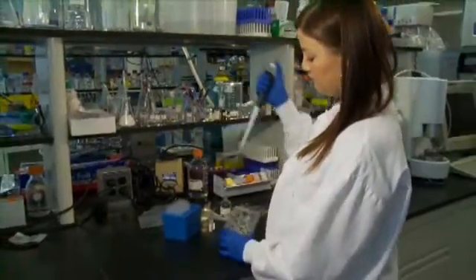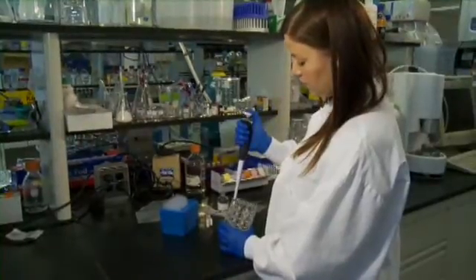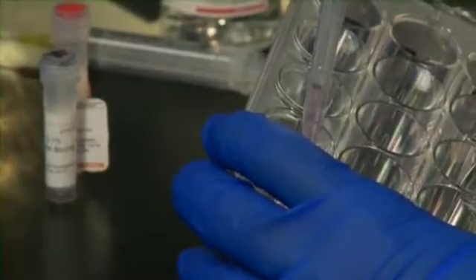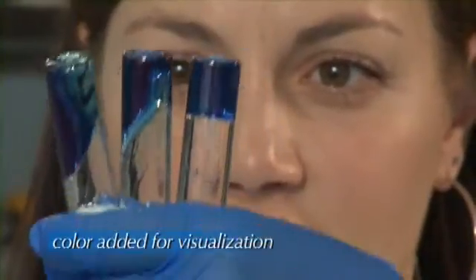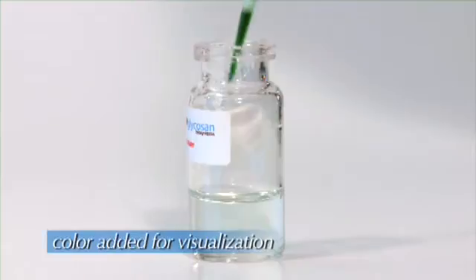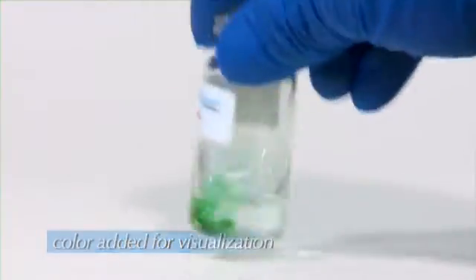HySTEM's unique chemistry also allows for easy customization of the hydrogel to optimize experimental conditions. Simply change the amount of cross-linker to change the stiffness, or add an ECM protein or growth factor.